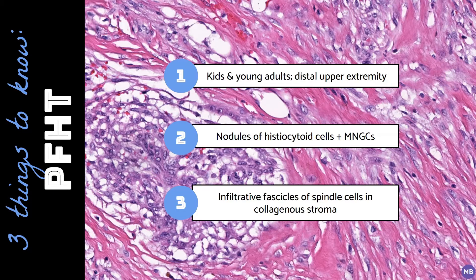This is an example of plexiform fibrohistiocytic tumor, a biphasic soft tissue neoplasm that most commonly presents in children and young adults as a slow-growing plaque on the forearm or hand. This lesion is composed of nodules of histiocytoid cells surrounded by infiltrative fascicles of spindle cells.